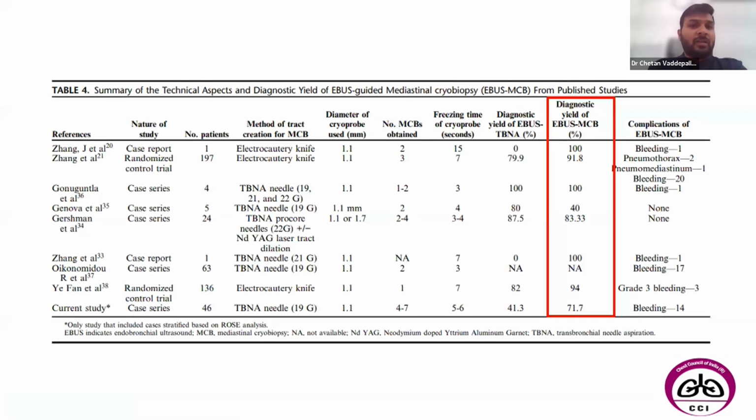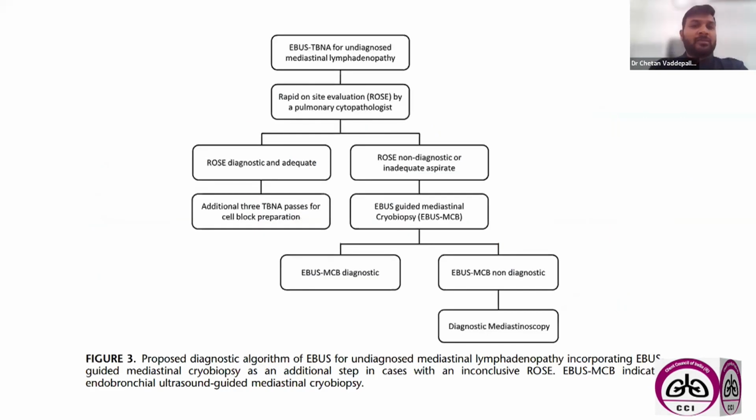And we also looked into the data that has been published on the same technique. And if you can look at this area, this is the diagnostic yield of EBUS mediastinal cryobiopsy. And this is significantly better when compared with diagnostic yield of EBUS TBNA. And these are the reported complications. And this is the algorithm that we use at our center. And this is the algorithm that we proposed.